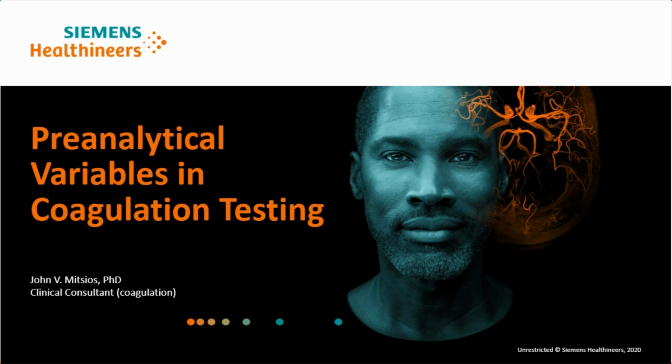Pre-analytical variables and unsuitable samples can account for up to 70% of lab errors. These errors can be attributed to improper specimen collection, specimen transportation, specimen processing, and/or storage. For coagulation, challenges both outside and inside the laboratory's control can mean the difference between accurate and potentially inaccurate results.